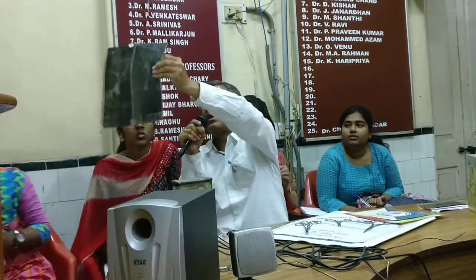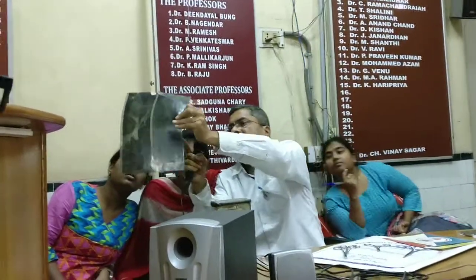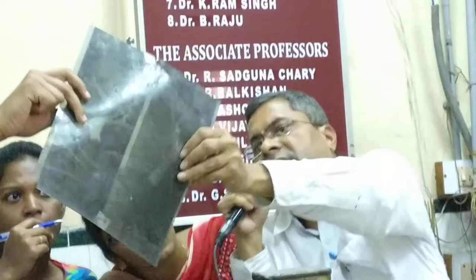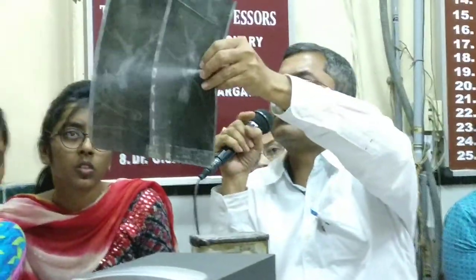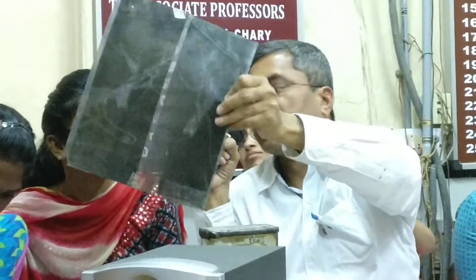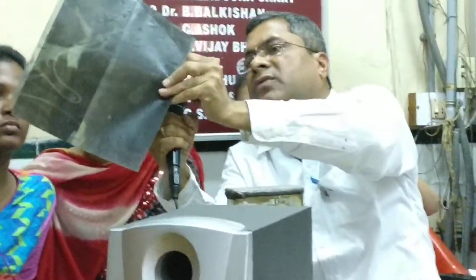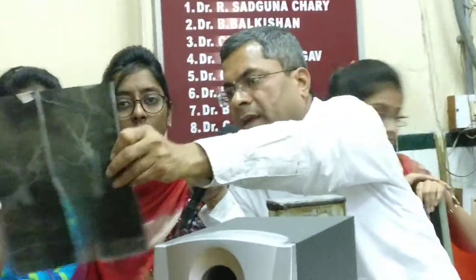So the T-tube also looks like this. T-tube limbs are there, and this tube is coming out, it is the CBD. So this is T-tube drainage. After choledochotomy, you put the T-tube and suture the CBD. So the T-tube is there, here we can see the T and this is the outer limb.